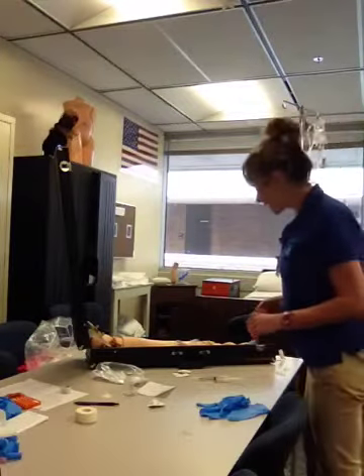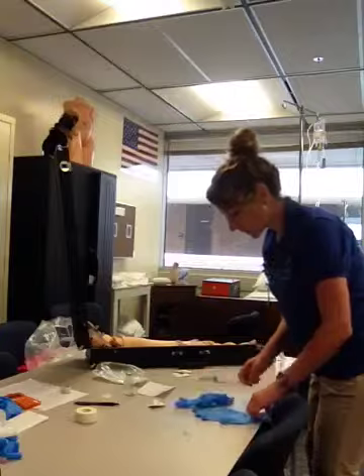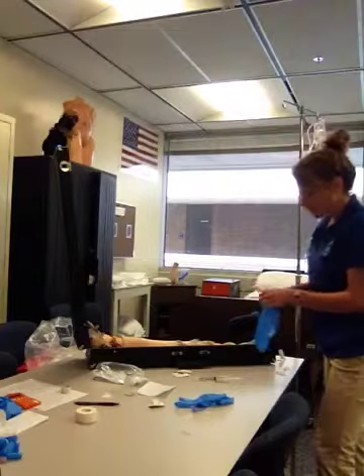Okay, and at this time, I'm going to put on my gloves.